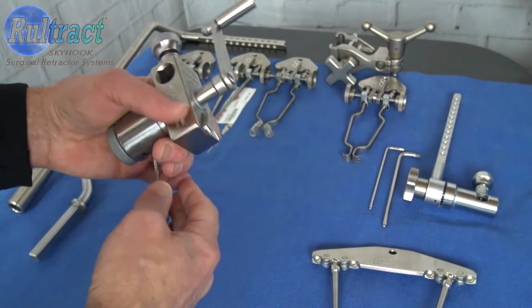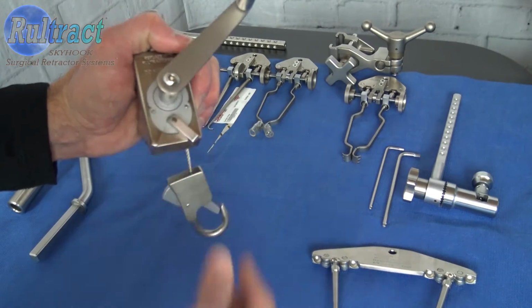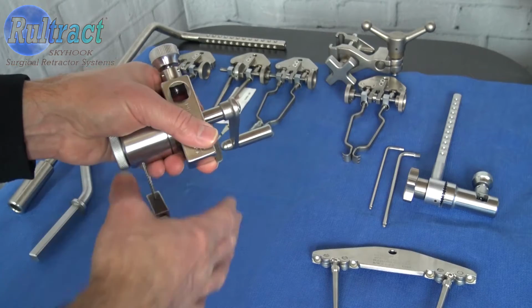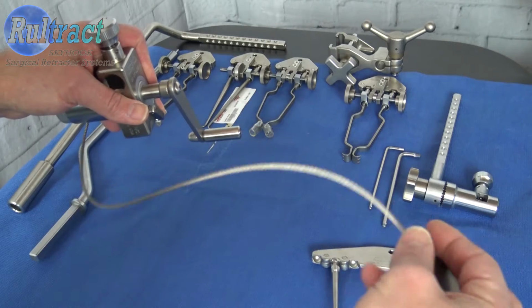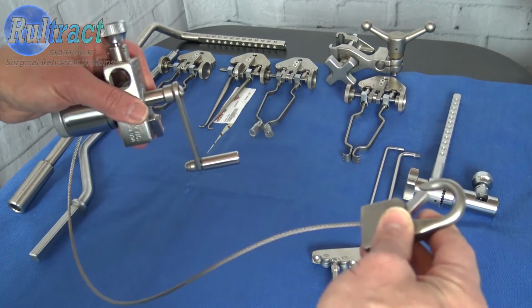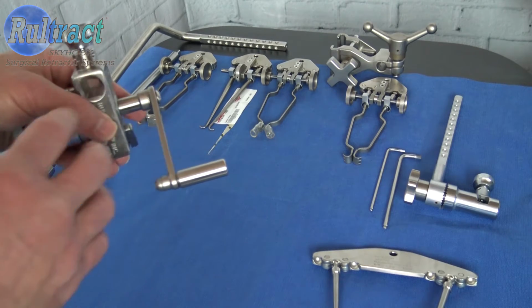If the cable doesn't come out, just flip your reversing ratchet lever to the opposite side. Again, making sure you're holding the spool. Now you can go ahead and pull that cable right out. A fully exposed cable is about 16 inches, so that's when you know you've got all the cable out of the spool. Next, we're going to remove the spool cap nut.